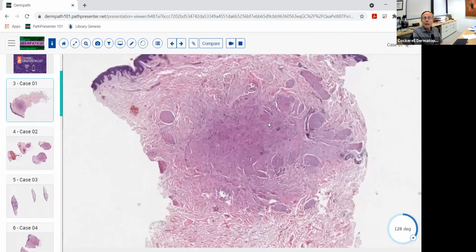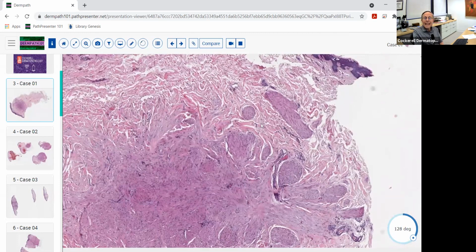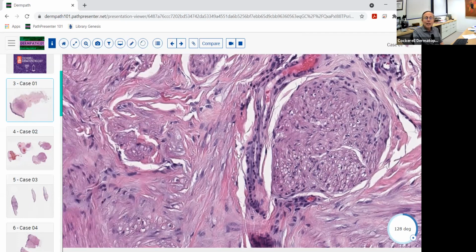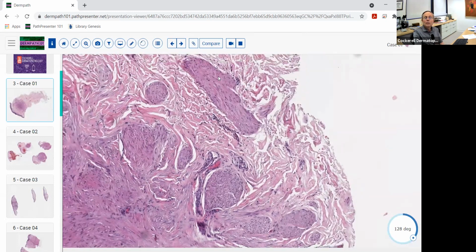And if we go to higher magnification, you can see that they have these small fascicles of cells comprised of these cells with these elongated, almost cigar or blunt shaped nuclei, often with some perinuclear vacuoles. When you cut those in cross section, you see the vacuoles over here. And the cytoplasm of these cells is usually relatively ample. It's somewhat eosinophilic, like you see here. And it looks pretty much just like a normal garden variety smooth muscle bundle.